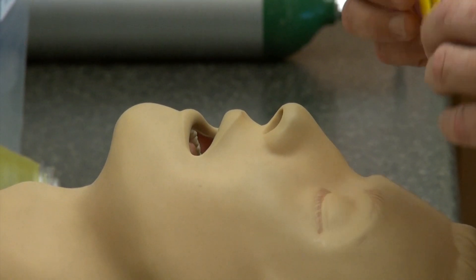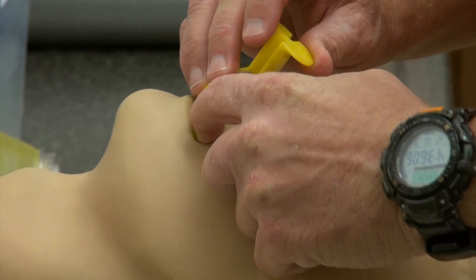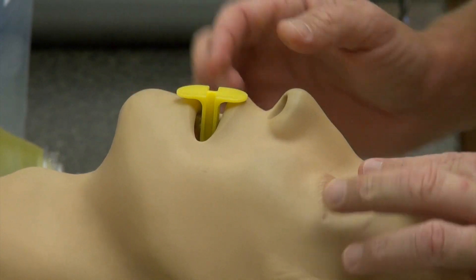The second way of placing an OPA is using the angle into the hard palate and rotating 180 degrees until it rests into place in the center of the mouth.